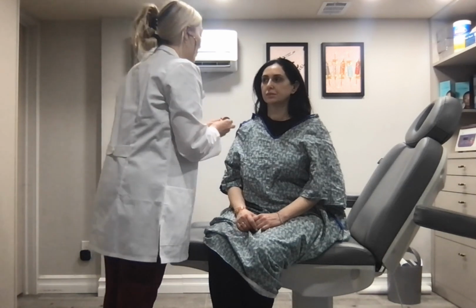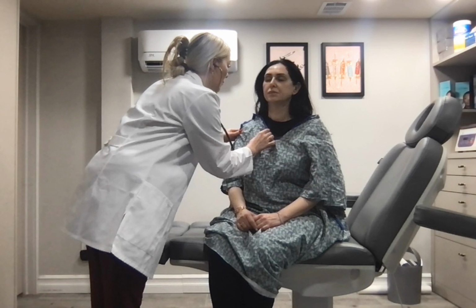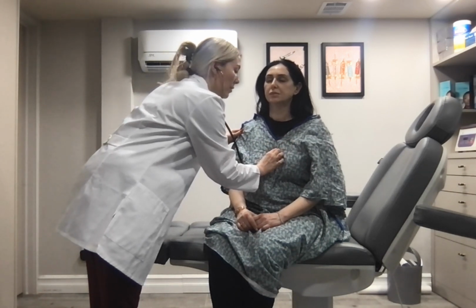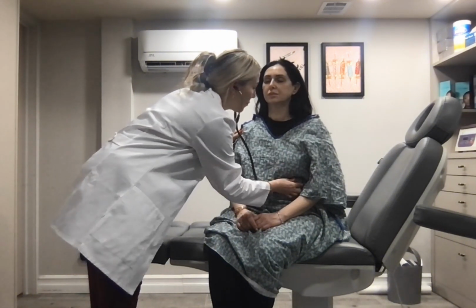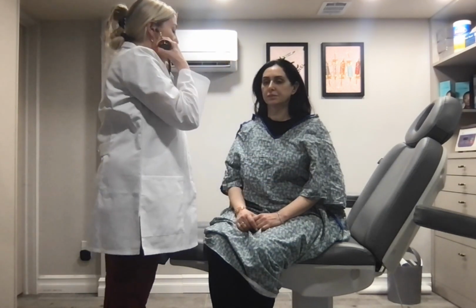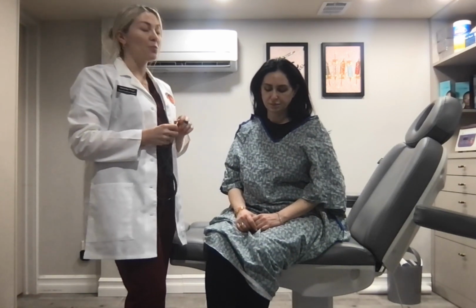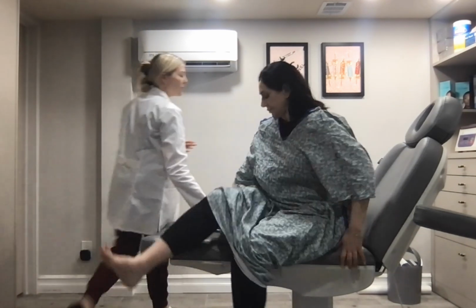Okay, and I will be doing the same assessment, but with the bell. Aortic, pulmonic, Erb's, tricuspid, and mitral. Okay, I hear S1 and S2 heart sounds, no extra heart sounds present, no S3 or S4, no murmurs present or heard. Next, I'm going to have you lie down for this assessment.